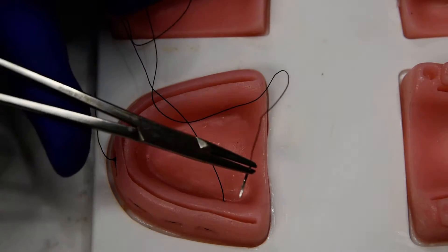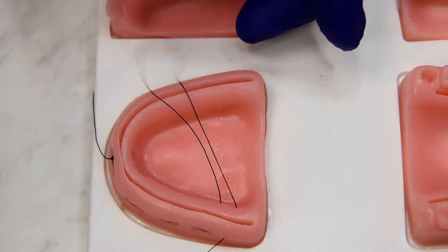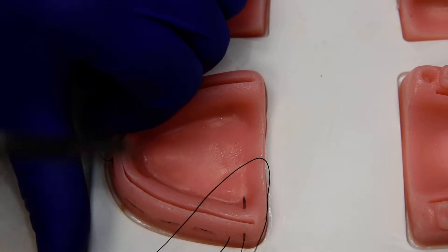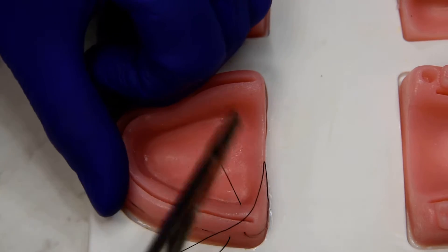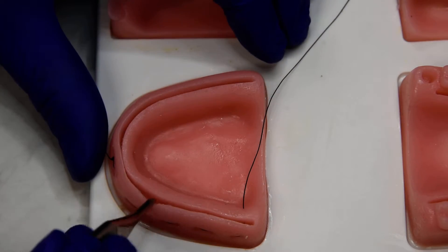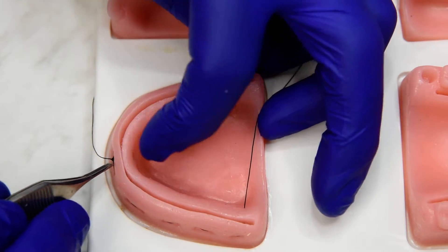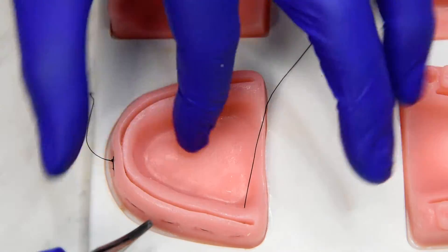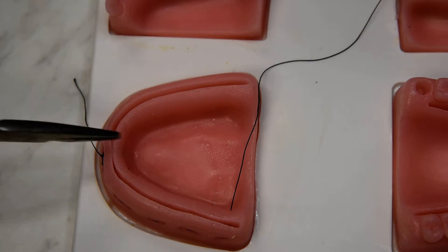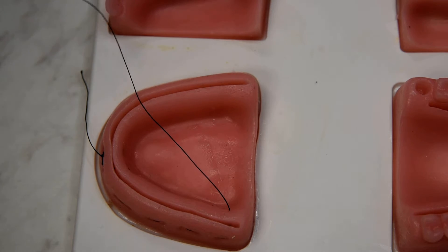And as we get near the end, we'll do one more because I want to end on the palatal. So now we have our mattress on the whole quad, which has no tension across the incision line, but it is everting the tissue — which you can really see here. It's kind of turning the tissue up and allowing us to get a more deep tissue-on-tissue touch. So we've done our mini mattress tied off and a continuous mattress ending in the distal palatal.